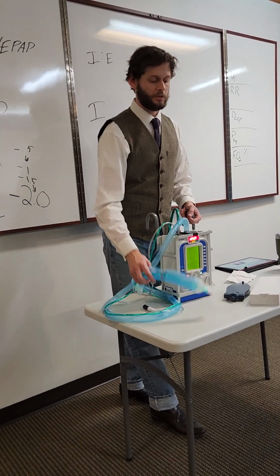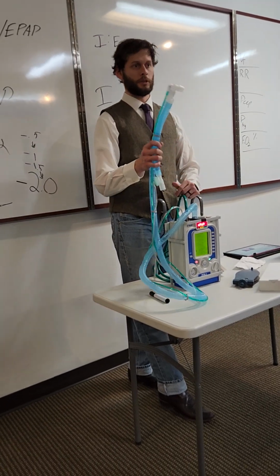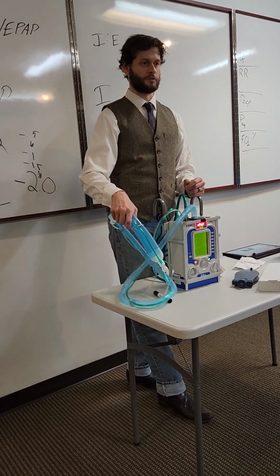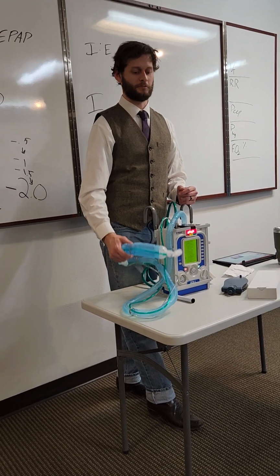The other problem is that you don't have the cap on this. So careful where you put this so you're not dragging it along the floor or something like that. Scooping up Lord knows what in the hospital.